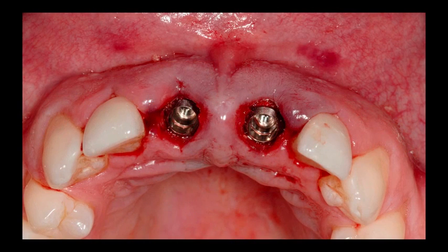A couple of things that Jim did to create an opportunity to maintain the papilla. He placed the implants slightly palatal so that we've maintained the buccal plate of bone. We've also placed the implants at the correct depth relative to where the CEJ, or the gingival margin, will be. And the other thing he did was place the implants with enough space between the platforms. The papers that you would read about this technique would tell you that you need a minimum of 3 millimeters between each implant platform to preserve the inter-implant peak of bone as much as possible.